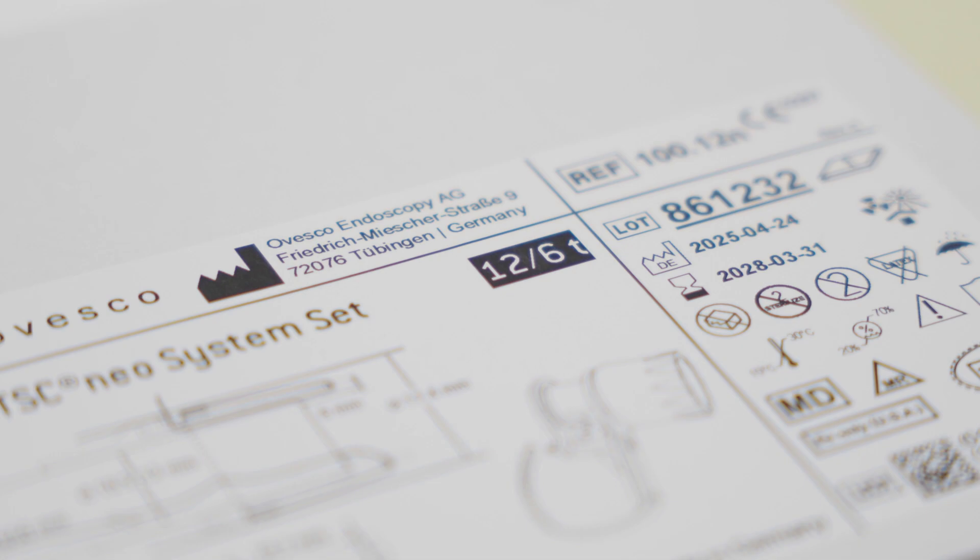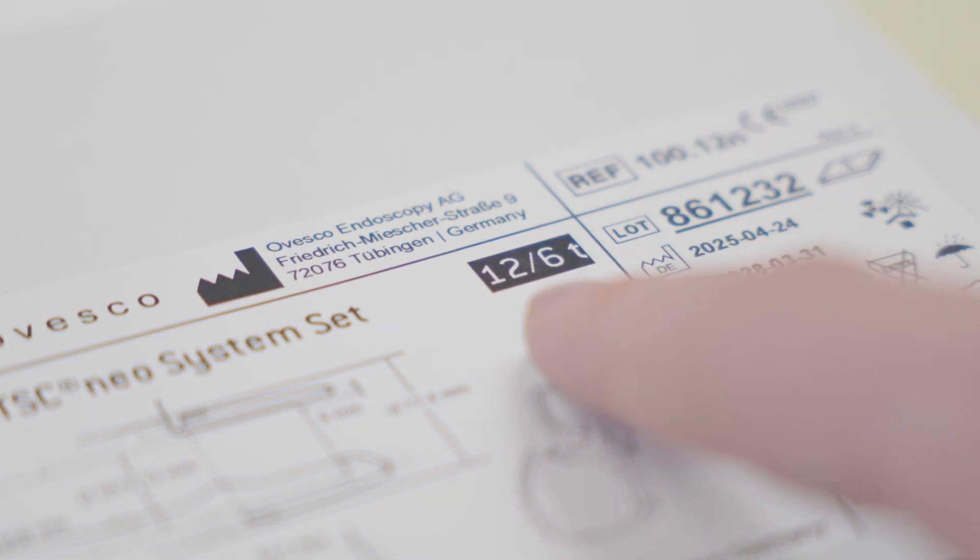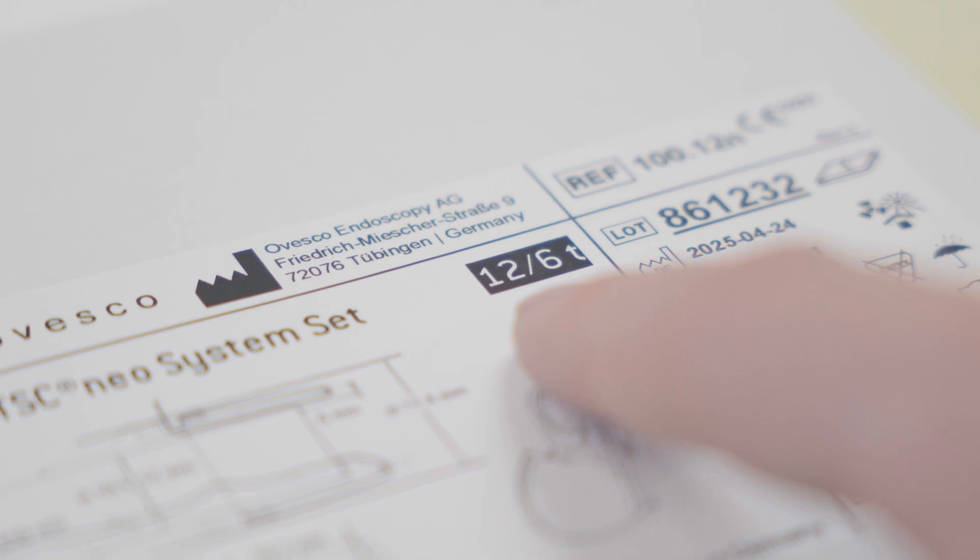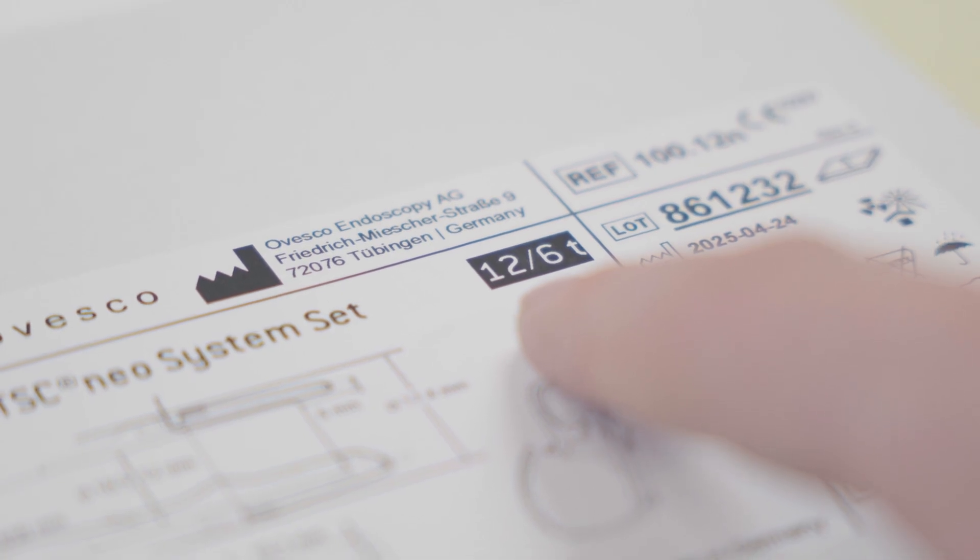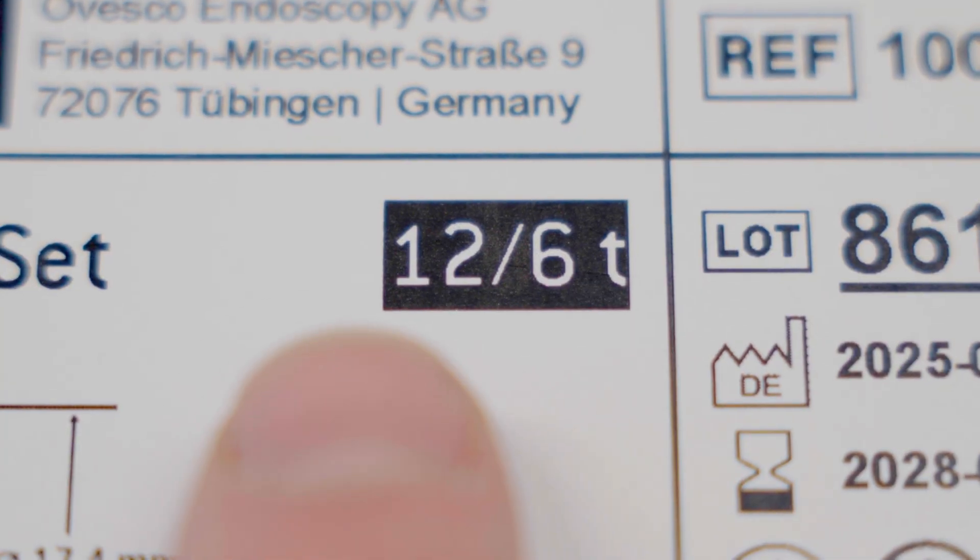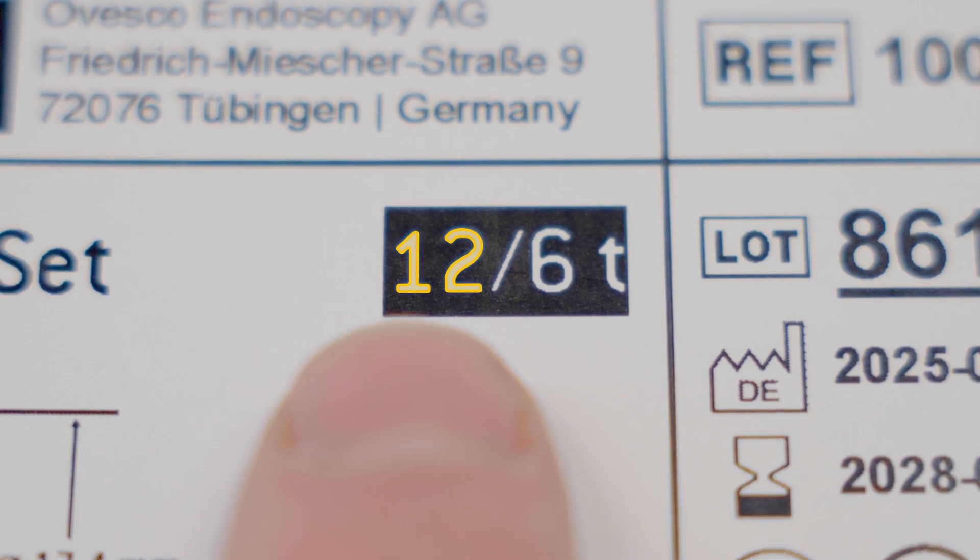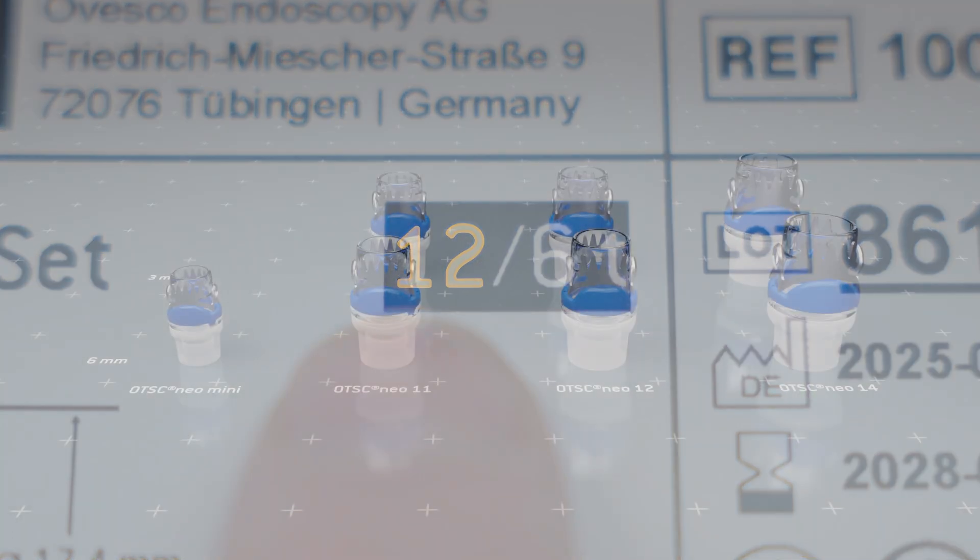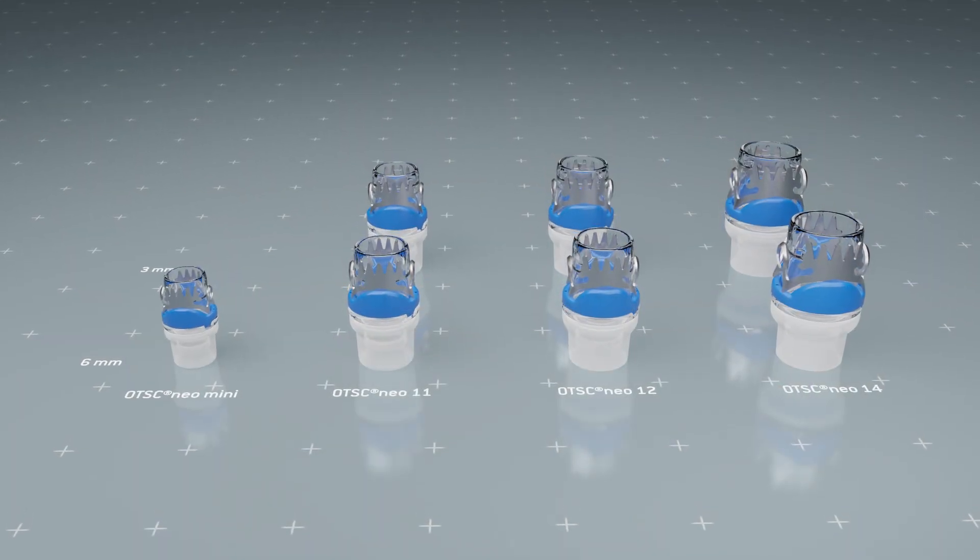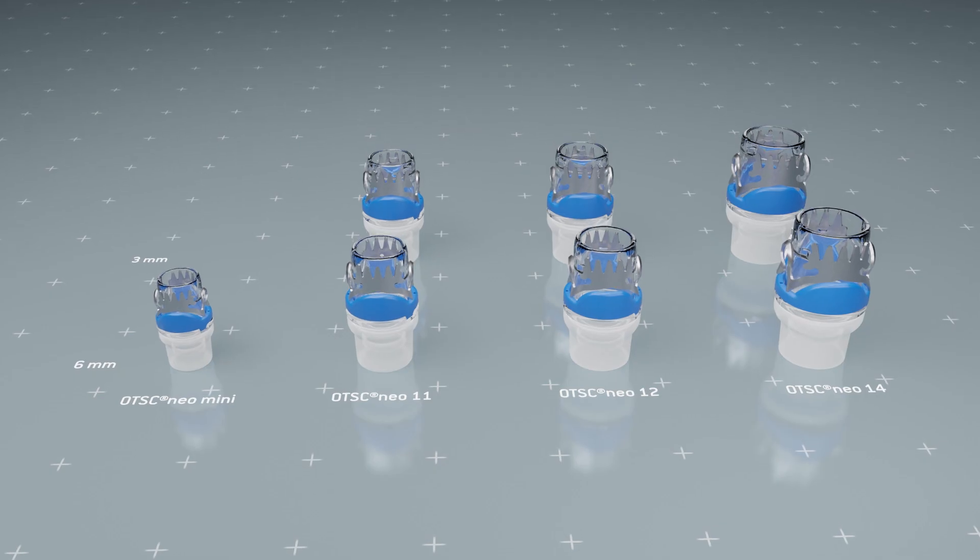The identification codes on the packaging of the OTSC NEO system provide information on compatibility, cap depth and clip-tooth geometry. The first number refers to the maximum compatible outer diameter of the endoscope. The system is available in sizes 11, 12 and 14, as well as in a mini version.